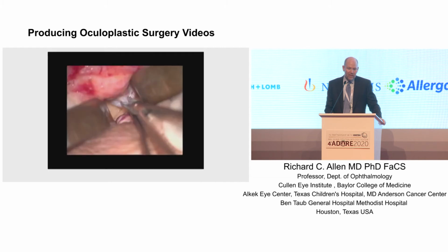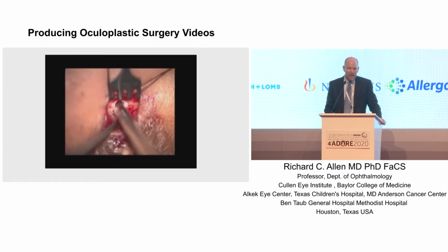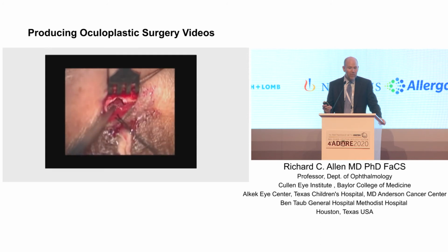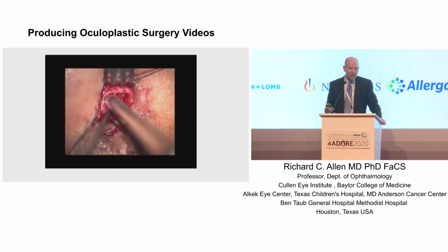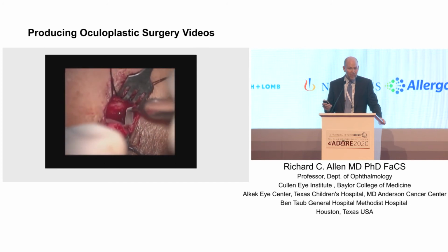So we're just isolating the optic nerve there, making an incision in the optic nerve sheath to do a fenestration for a patient that has idiopathic intracranial pressure or pseudotumor cerebri. And so a nice thing to do if you're trying to demonstrate everything. And again, this is a DCR through the microscope. Again, a difficult surgery to video with a ceiling-mounted camera.